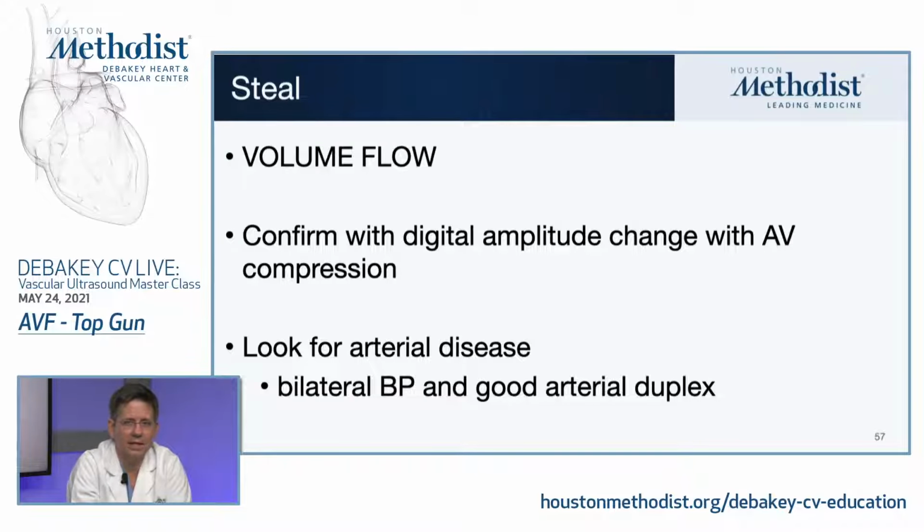Steal is, again, one of the biggest issues in dialysis. Maturation, I'd say, is one of the most common problems we face, but steal is one of the most dangerous problems we face because the consequences of this can really be terrible. When you're doing studies for steal, it's crucial that you're looking at the volume flow because high flow, low flow, adequate flow really determine what the clinical path is going to be and what the needs of the patients are.